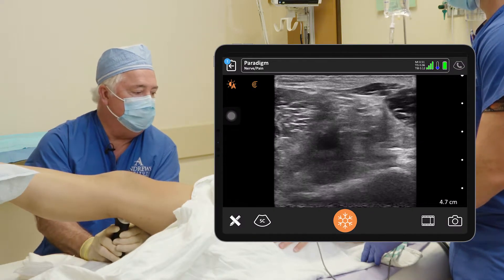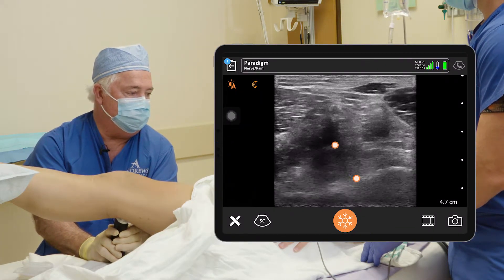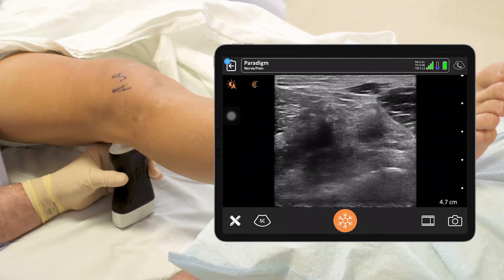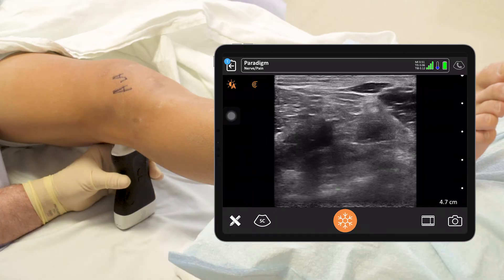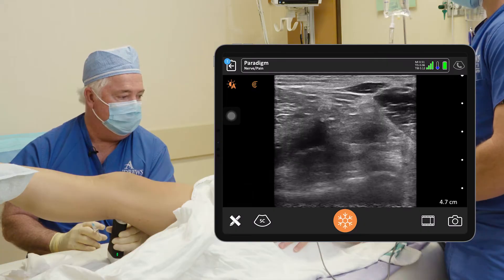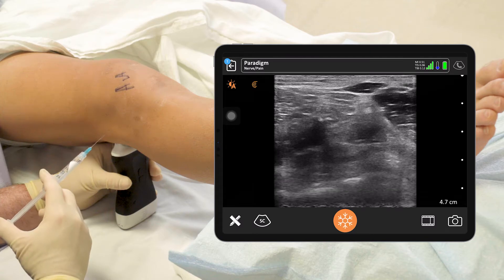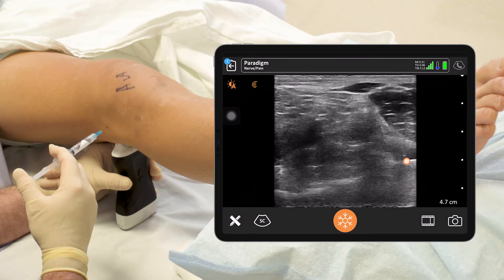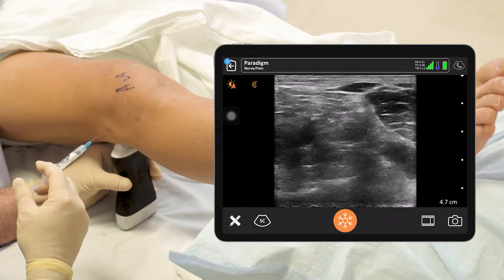Now I can see the posterior femur, and I'm going to come in between the femur and the artery. You can see the artery pulsating in the middle of the screen. We're going to come in from the right side and work our way across and infiltrate between the popliteal artery and the posterior capsule of the knee — thus the IPAC. So a little numbing shot, here's a big sting. One, two, three. There we go — see the needle coming in? That's really just our skin infiltration there.